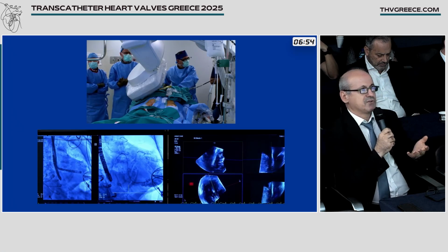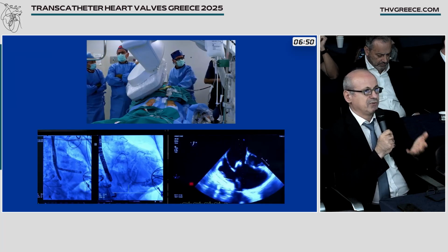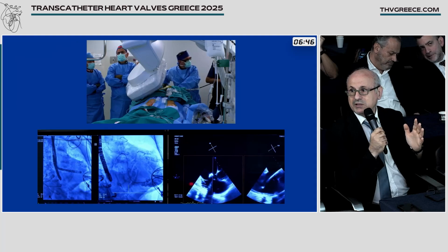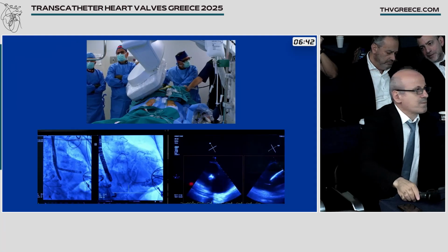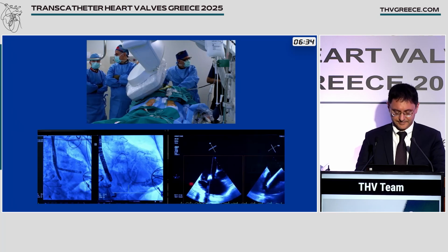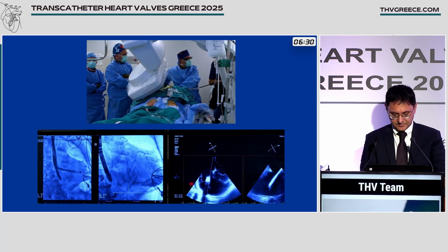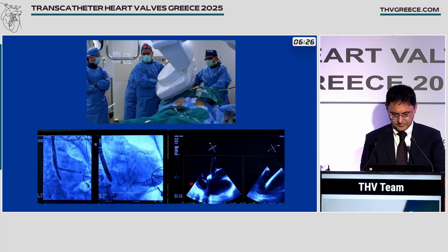So you have two ways: if you just want to come anterior, you flex the system. But if you want to move the whole capsule anterior without changing the angle, you just pull it back. It looks like the maneuvers that you use in MitraClip. It's similar to the maneuvers you use with TriClip or PASCAL in the tricuspid, the anterior and posterior. Yeah, and the terminology is similar.